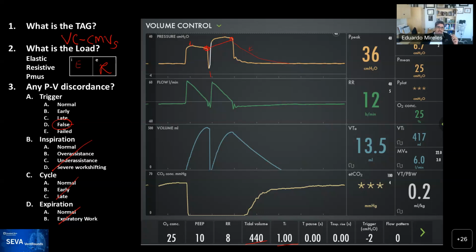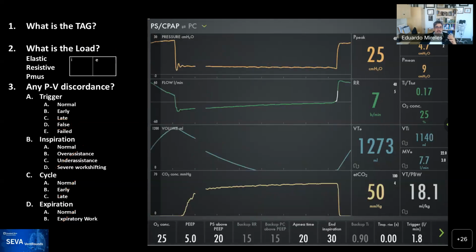And so the question is, now you're at the bedside and you see this. So the first thing that we did at the bedside, I'm gonna show you, the patient was on high pressures. We changed the patient to pressure control, pressure support. The patient was awake and able to trigger the breath. Actually, it was overventilated, you can imagine. And we changed him to pressure support because if you double trigger with pressure support, you have less volume delivered than what the patient had.